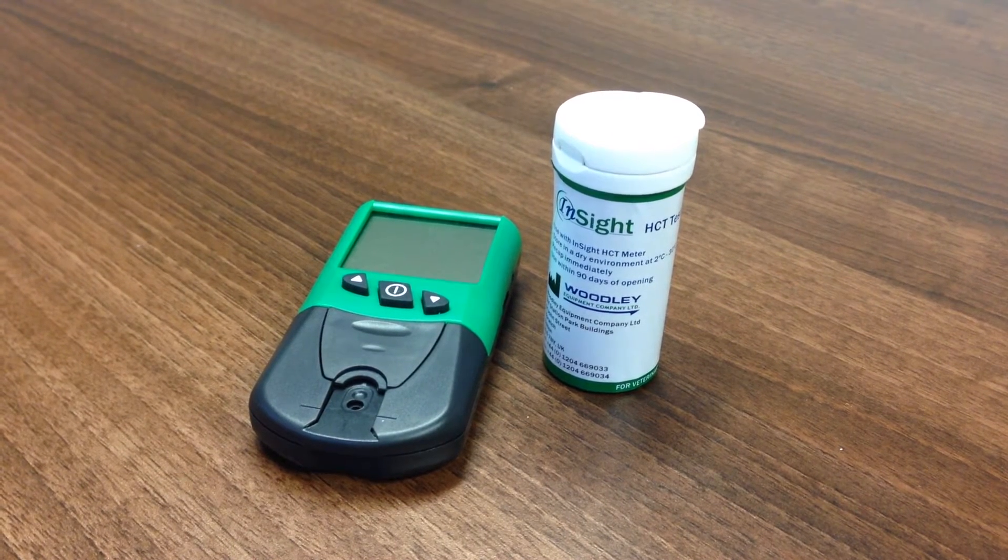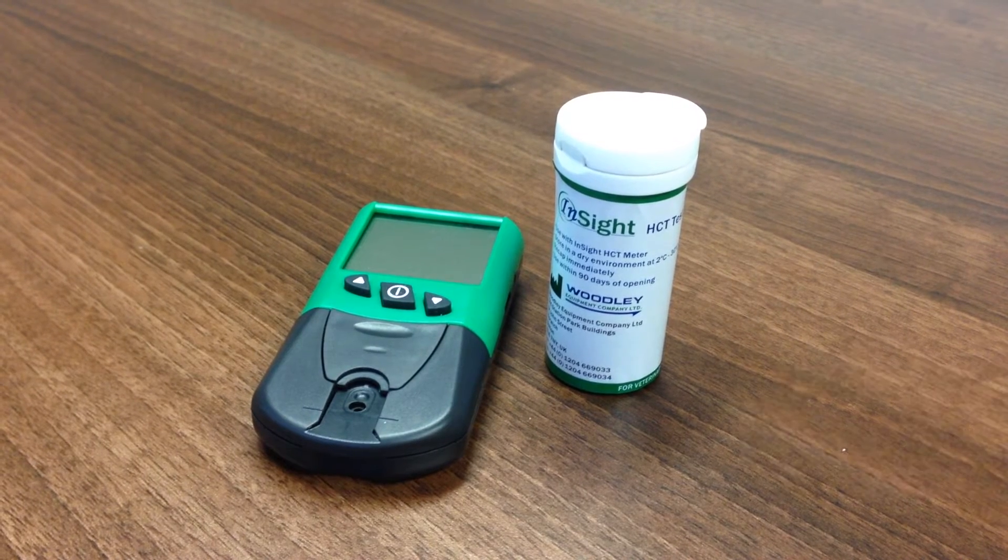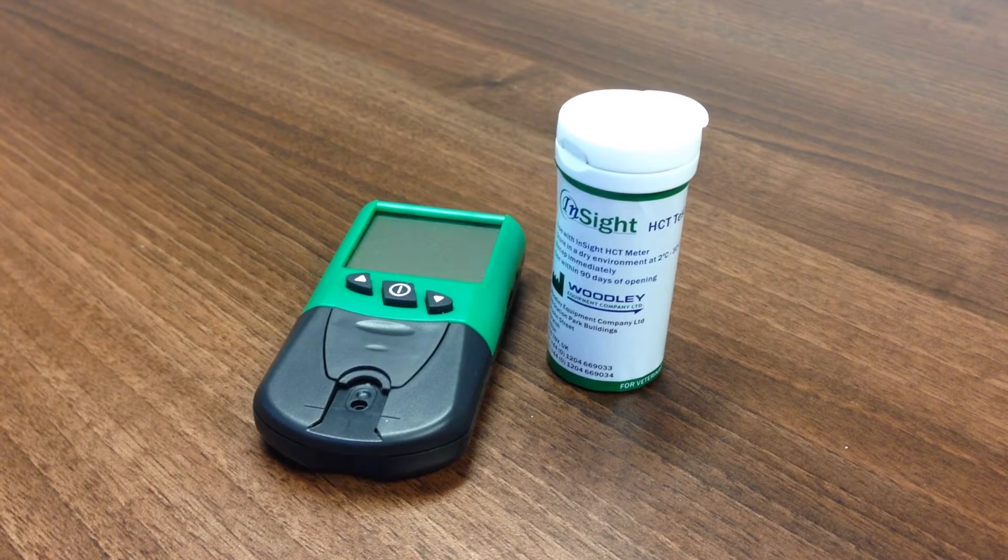The meter features room temperature storage test strips, a 30 second test time, stores 250 results, and is specifically calibrated for cats and dogs.